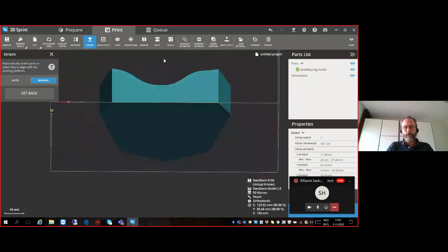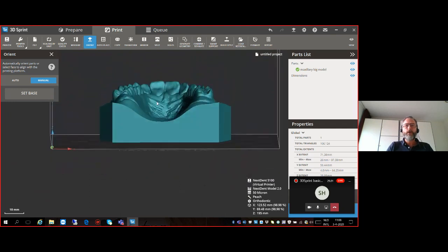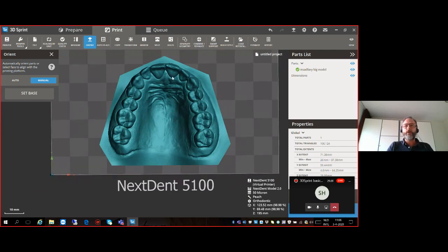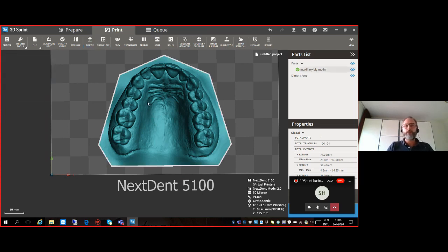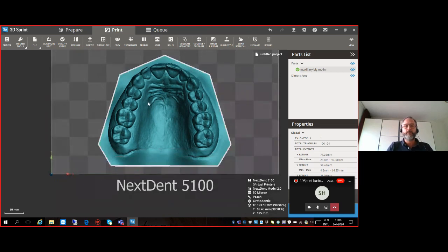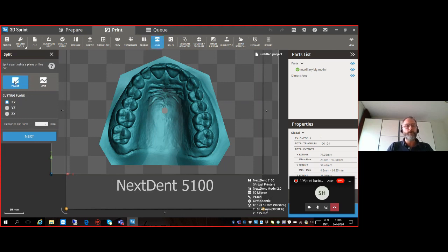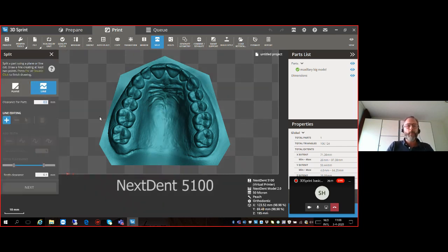We can also see this model is a solid closed model. On the Next Dent 5100 we strongly advise printing with hollow models. We selected the orthodontic build style, and let's say after printing this model we want to vacuum cast something like a retainer or aligner — we don't need all this mass. Let me show some tips and tricks on how to change this. We have the Split option. Select it, and you have two options: Plane and Line. I'll select Line, and by clicking with the left mouse button I can create a line.